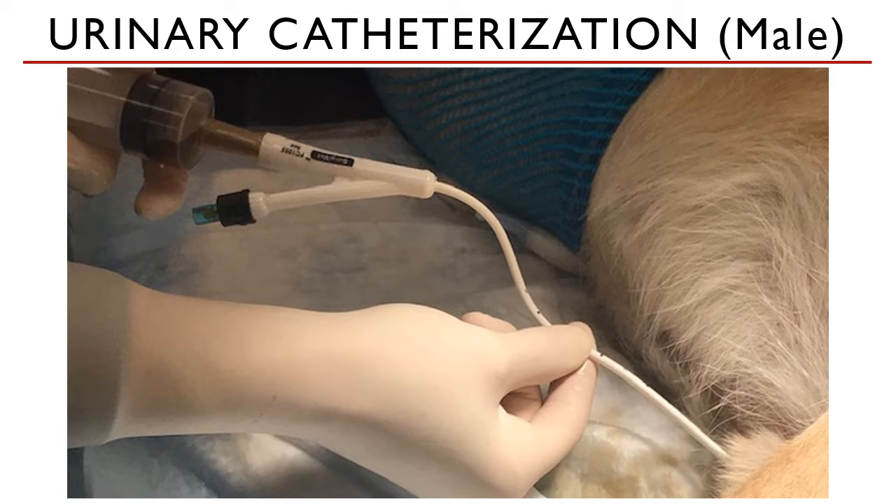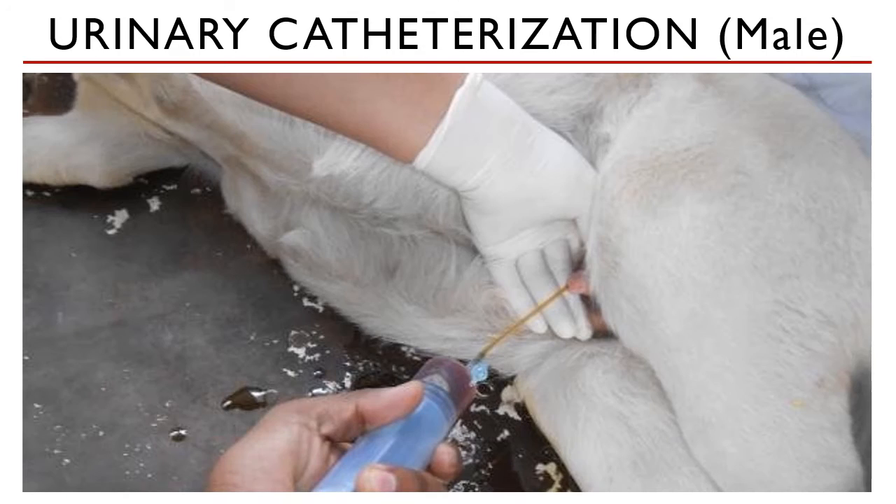Once urine comes out, you may start aspirating the urine from the catheter with a large volume syringe, as you can see right here. You may also place gentle pressure on the lower abdomen where the bladder is to drain more urine.